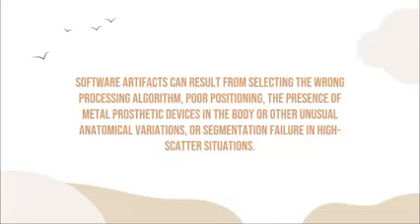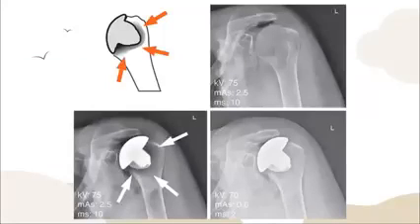Okay? Edge enhancement algorithms can produce substantial halo artifacts. These appear as dark bands at the interfaces of adjacent high contrast structures such as metal prostheses or a solid column bolus of barium. Okay? So ganito siya. When we use edge enhancement na algorithm sa atong image, as you can see, na ay halo.